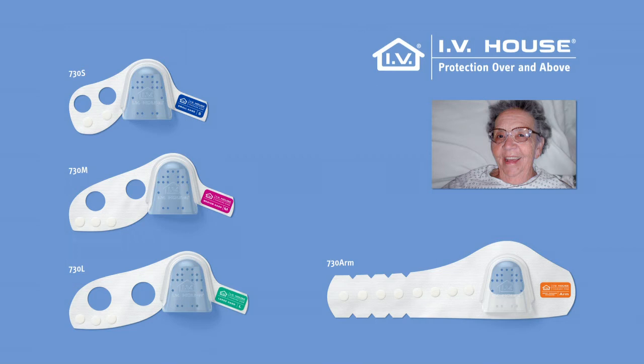The IV House Ultra-Dressing 730 series is available in three sizes for the hand: small, medium, and large, and one size fits all for the arm.